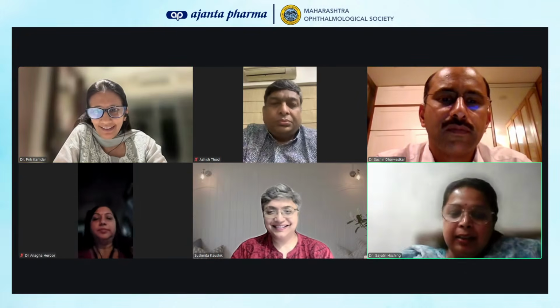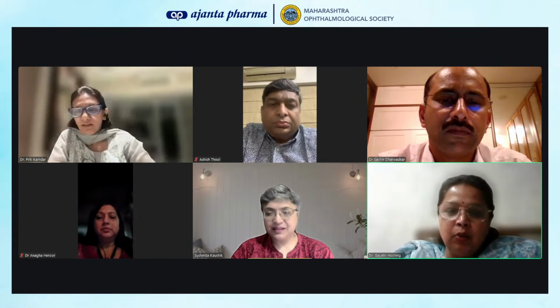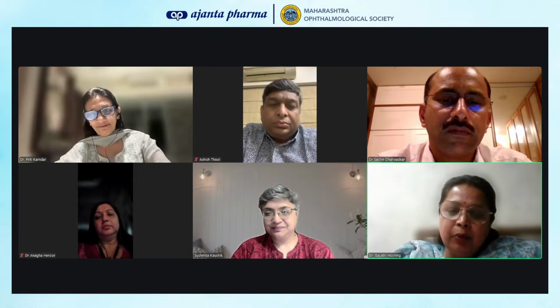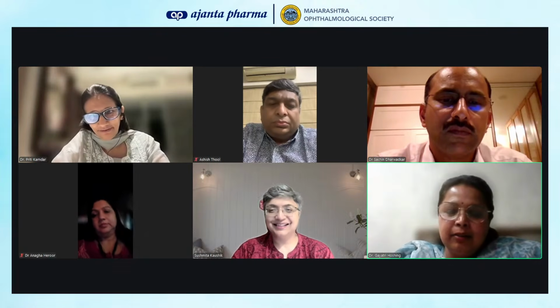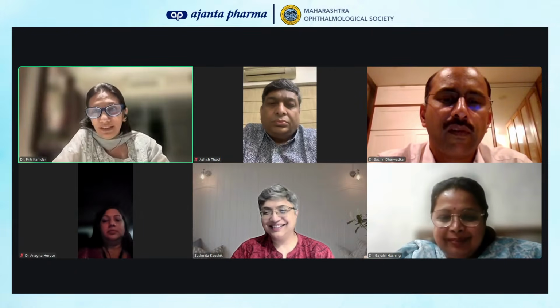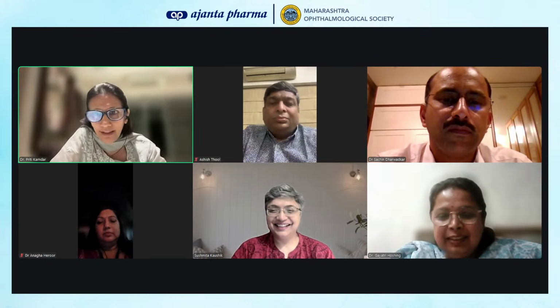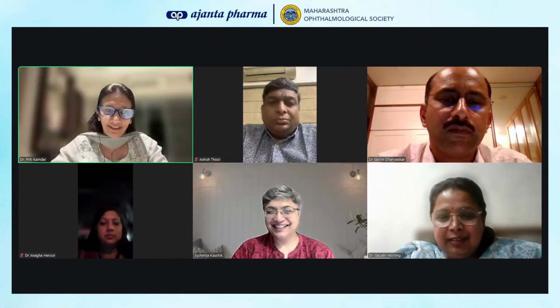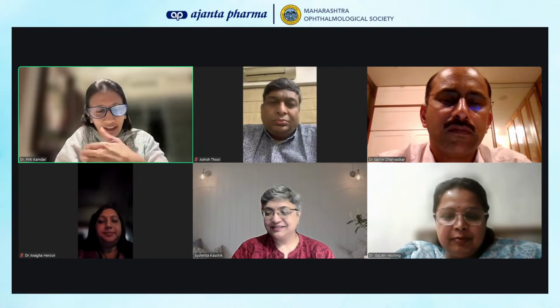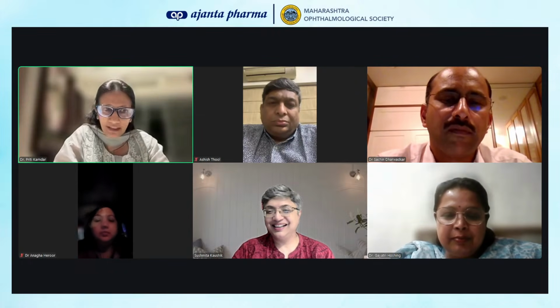Any tips? Yeah, I would just like to tell, I have seen many people treating glaucoma just based on OCT images. So I would request them to have a complete eye checkup, correlate it with your disc findings, and then treat, not just based on OCT. Yeah, that's a great tip. OCT is not glaucoma, and don't advise surgery based on a 5 micron change. So correlate, as Dr. Sushmita, Dr. Sachin, Dr. Ashish and Dr. Gayatri have said, correlate clinically and then decide whether this patient has glaucoma or not.